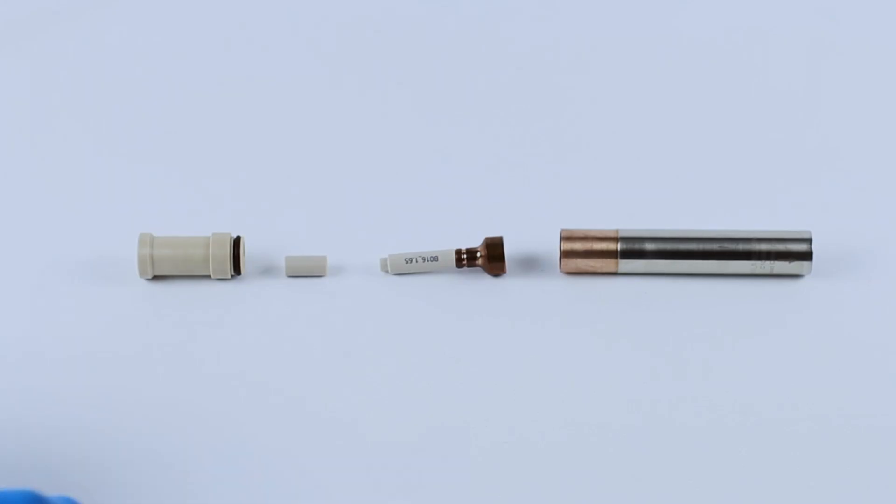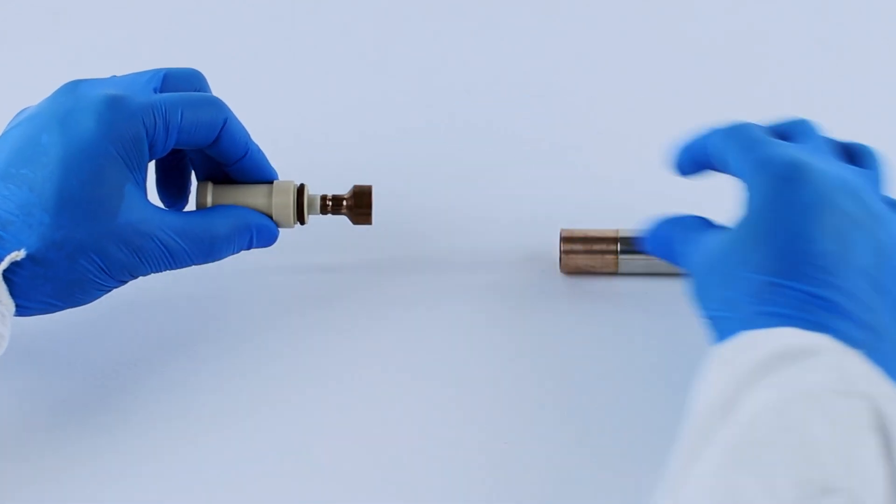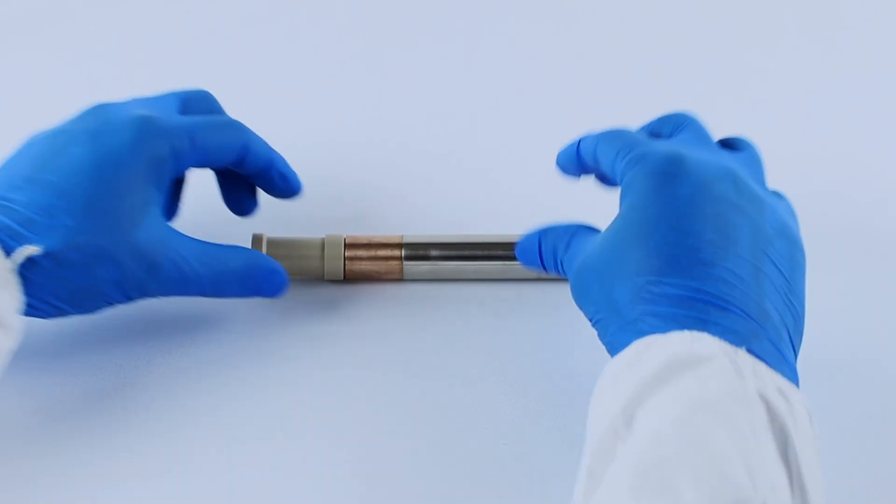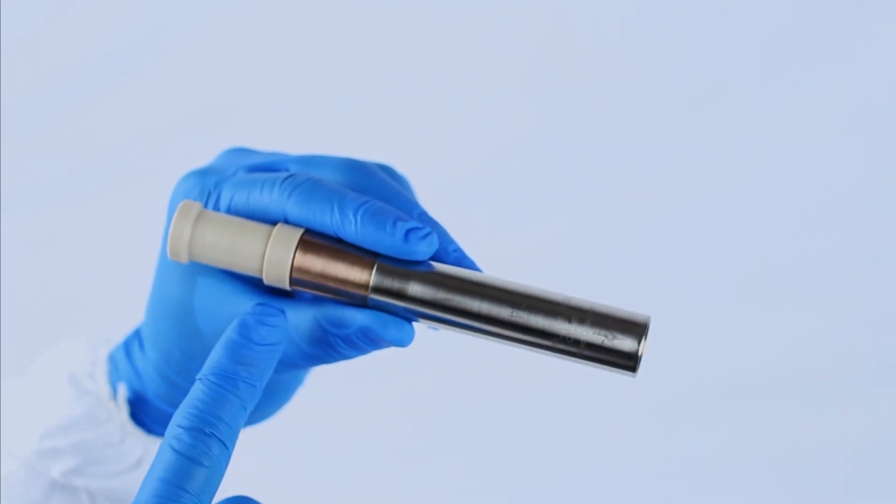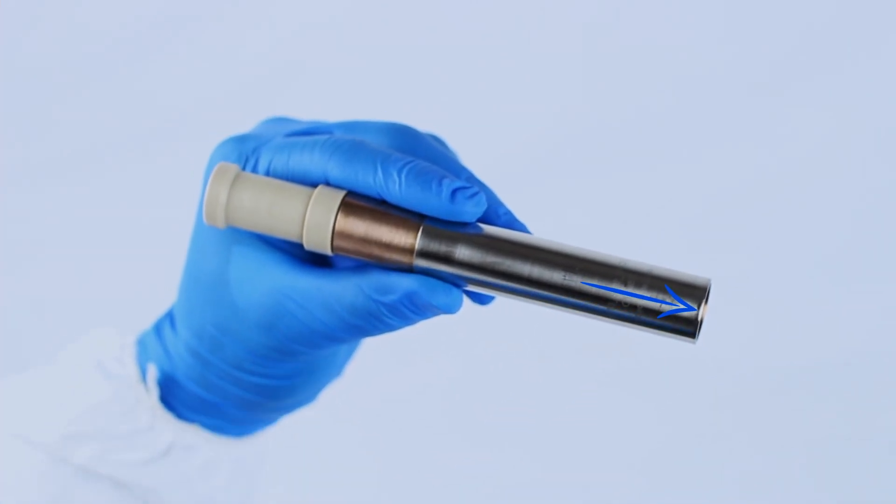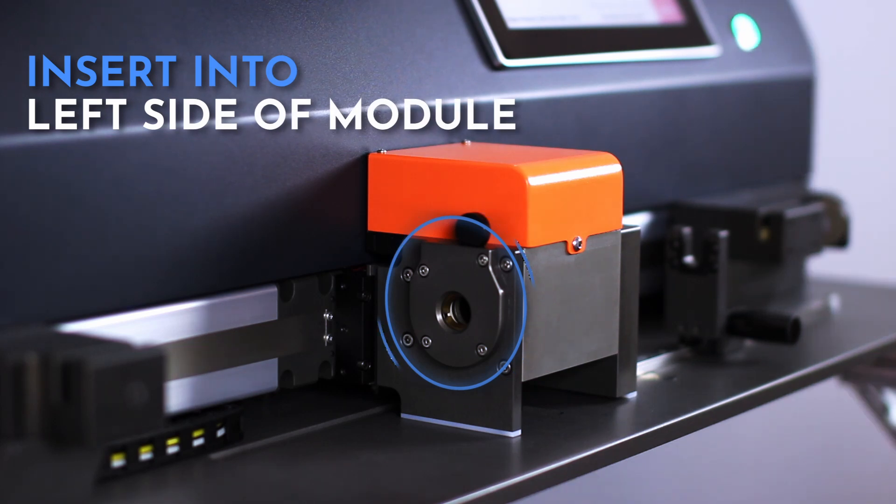To assemble the rest of the mold, first insert the end plug, then the spacer, into the left side of the mold center before inserting the mold holder. When the O-ring is properly seated, the mold holder should fit tightly with a small gap between the holder lip and the mold center. The arrow will always point toward the right side of the mold, which will first be inserted into the left side of the module.